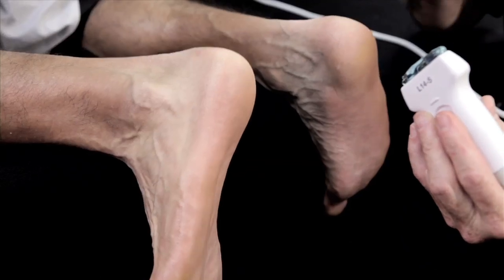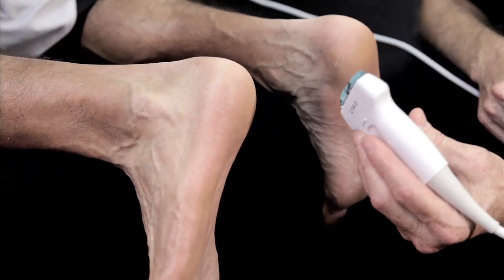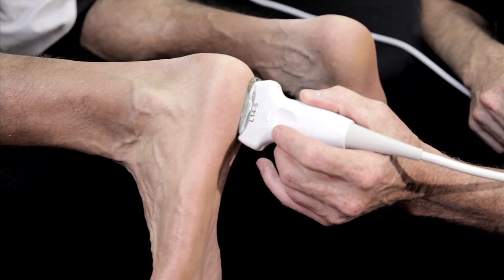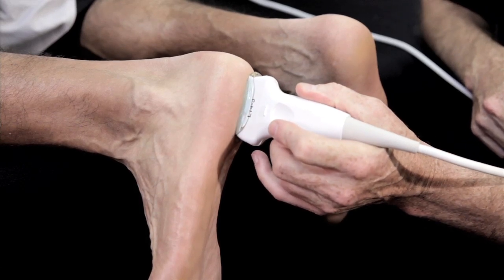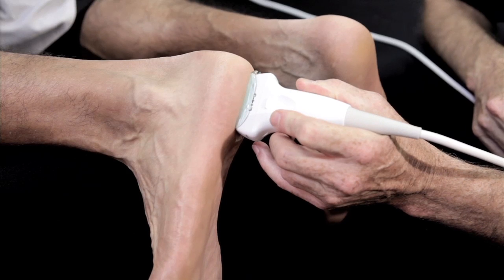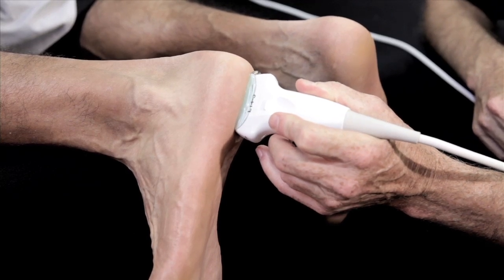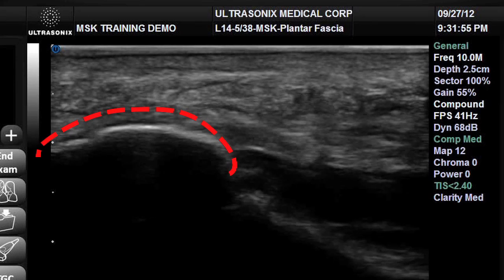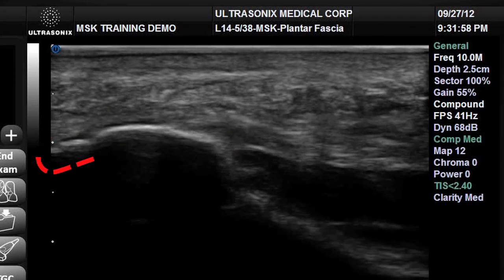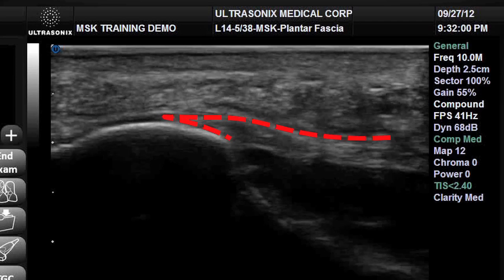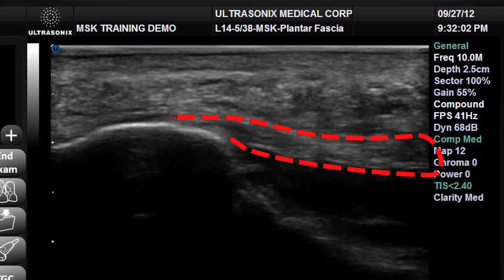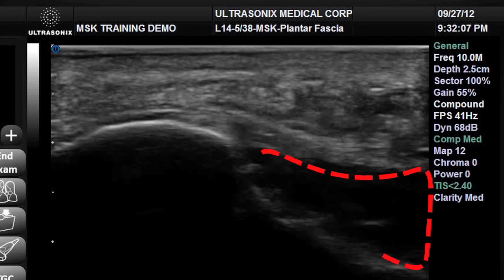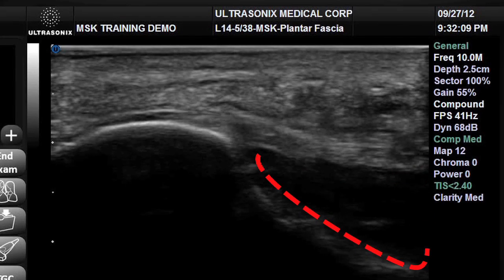With the patient properly positioned to expose the plantar aspect of the foot, we place the probe in a longitudinal orientation at the calcaneal margin and then slightly rotate it in an oblique orientation to visualize the medial attachment of the plantar fascia. We visualize the convexity of the calcaneus, and superficial to that the tapered attachment of the plantar fascia as it extends from left to right into the midfoot. The hypoechoic region deep to the fibers of the plantar fascia are the deep flexor muscles of the foot.